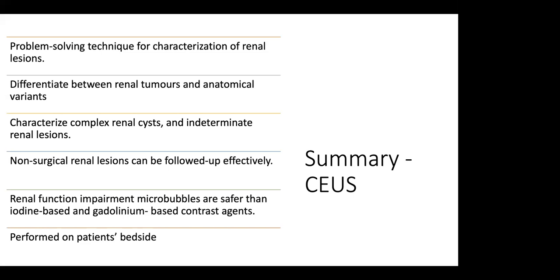The final bit was that because it is a study of the vasculature and the vascular characteristics of the mass, sometimes it requires more than one injection of the contrast. Sadiq can correct me if I'm wrong, but sometimes it may be up to 6, because I've seen it used very extensively in liver pathology, and in patients who have had transplants, for assessment of transplant dysfunction immediately after transplant.